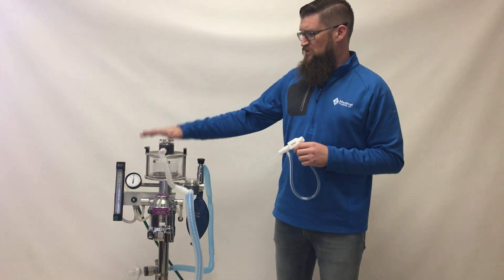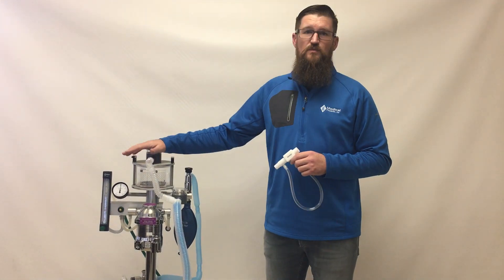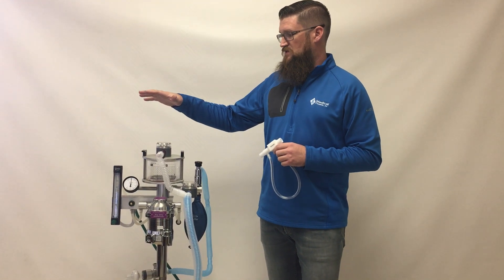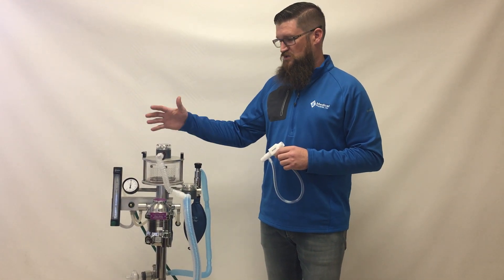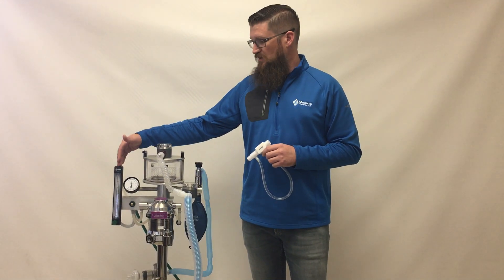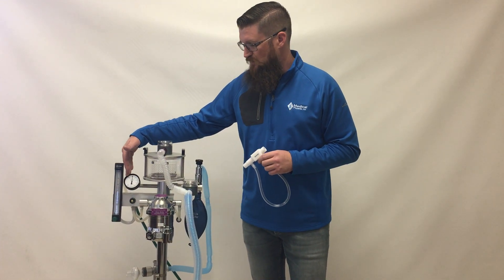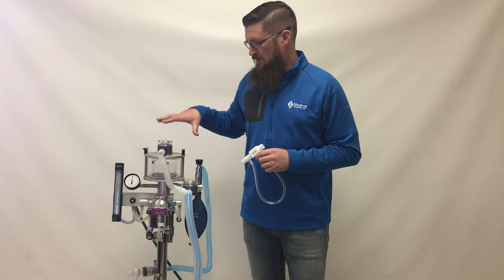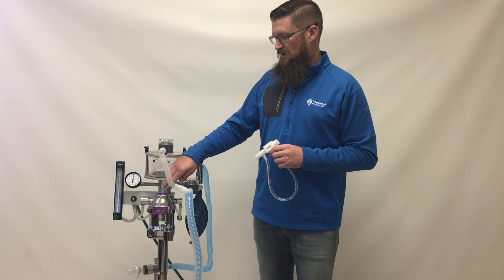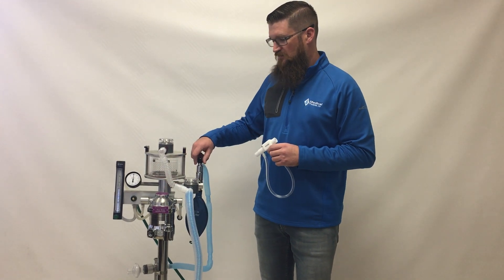For demonstration we have a standard JD Medical BT 110 small animal anesthesia machine, which is similar to any anesthesia machine you might find in the field. It has an oxygen flow meter, a pressure manometer, a circle absorber system with expiratory and inspiratory directional valves, an isoflurane vaporizer, and a pop-off valve.